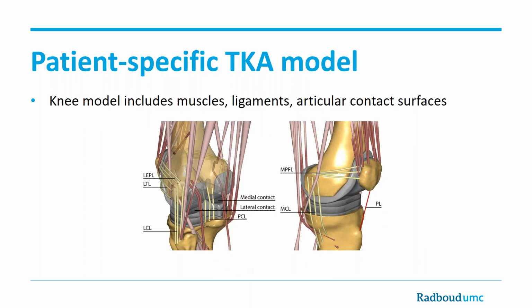So for that reason, in 2014 we developed this patient-specific modeling framework for total knee arthroplasty. And this is essentially an effort to make a model of the knee joint which is replaced by a prosthesis, and to be able to estimate relevant parameters such as muscle forces, ligament forces, and articular contact forces.